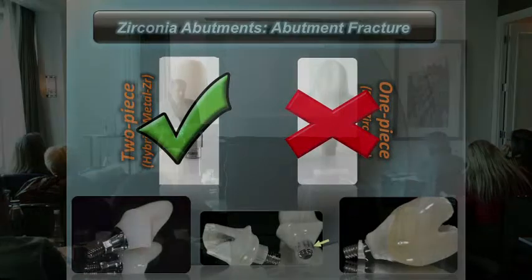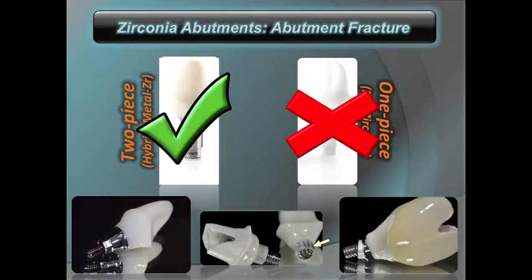To explain the matter a little bit better, as you can see here, this is a very nice, pretty zirconia. However, the connection is the weak link, and it's very dangerous to have this connection versus the other one. And this is called the full zirconia, or one-piece zirconia abutment.